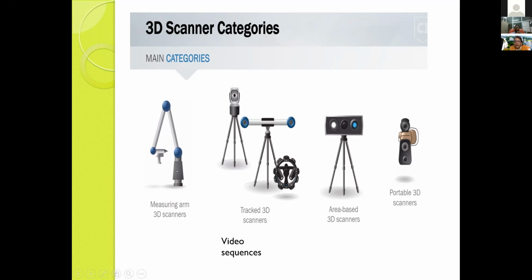Yes, Dr. Jiten, if you can show us the scanners, it would be good, because the workflow would be covered by Dr. Ashutosh after your lecture. Then he will be able to show us how the workflow is. Right now I am not going to show the demonstration directly, but I have taken some pictures. With the help of those, I will explain the things.